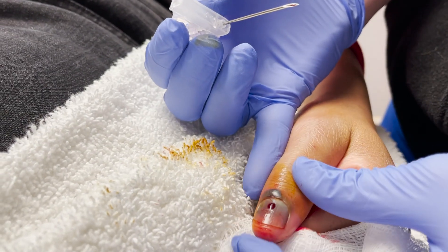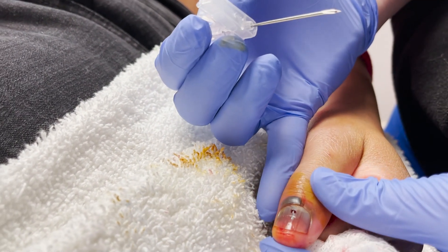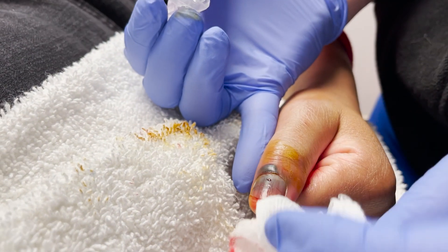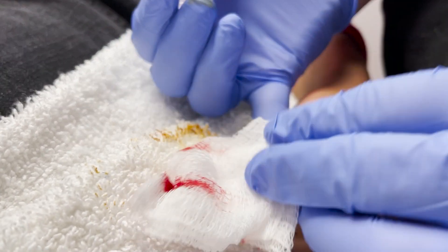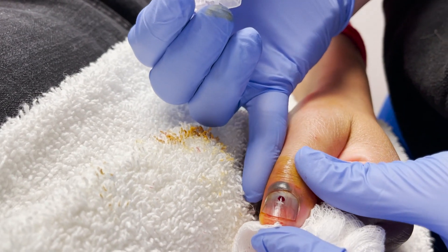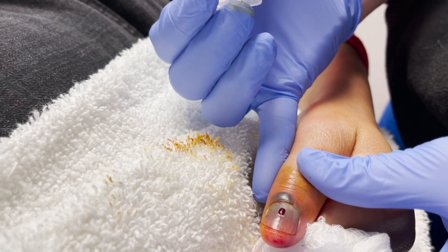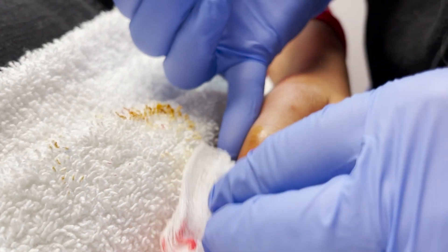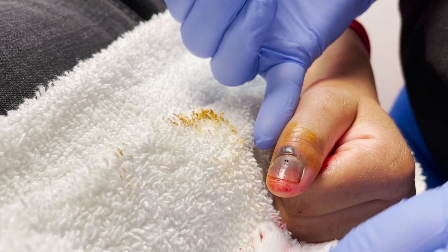Now you're starting to get some blood. Mom and daughter, if this doesn't continue draining, take an alcohol pad or something and just wipe it to make sure it starts bleeding again. Draining is what's going to keep the pain down. If we didn't do this, this would just be throbbing — in the middle of the night she would be saying 'mom, this hurts.' She said that last night.